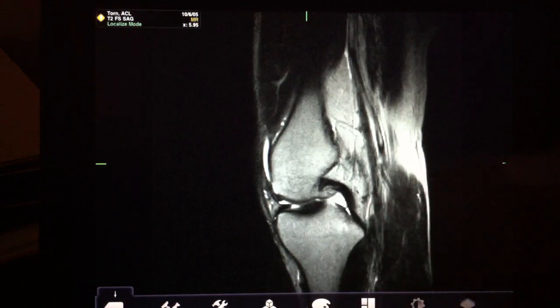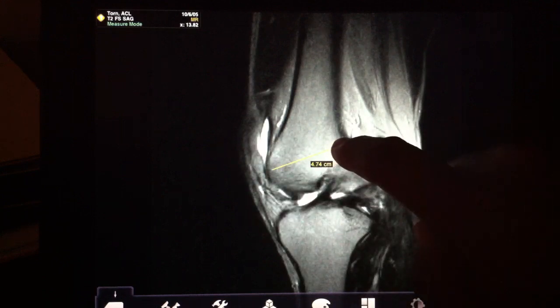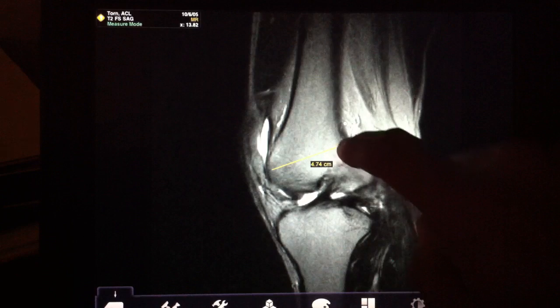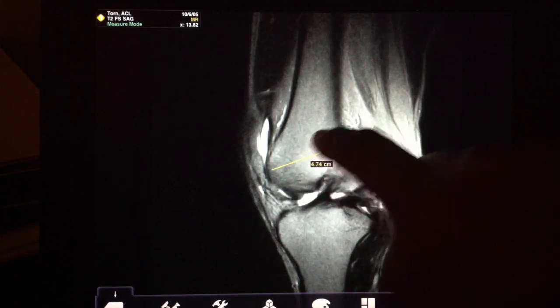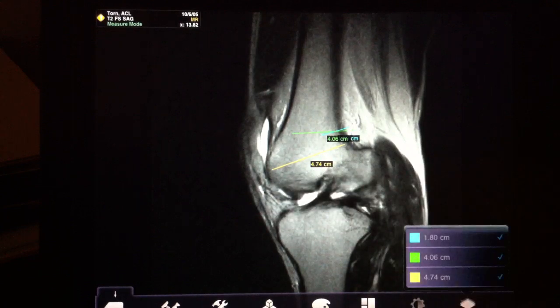The other functions available include measurement. This is performed by dragging to the first point and then dragging to the second point of interest, and then it'll draw a line. If you tap on the line again, you can make more measurements and you can see all the ones you've made.